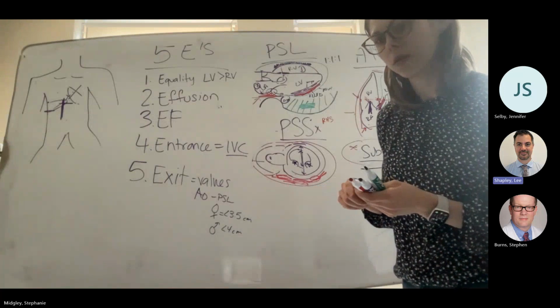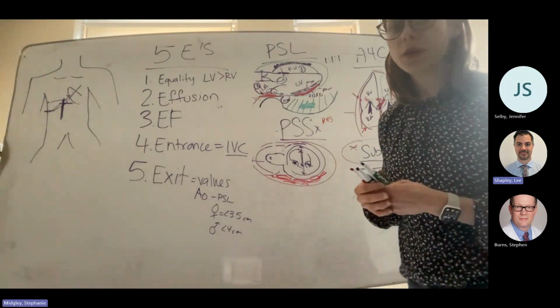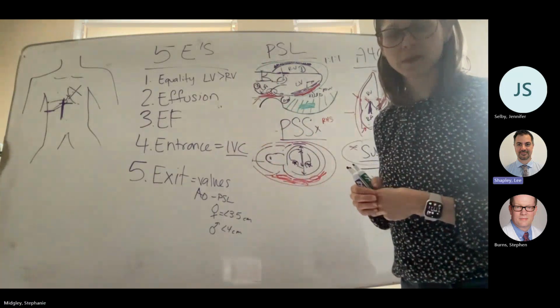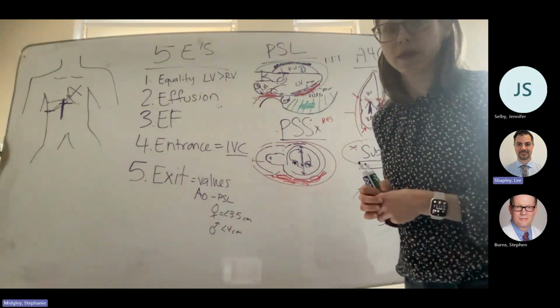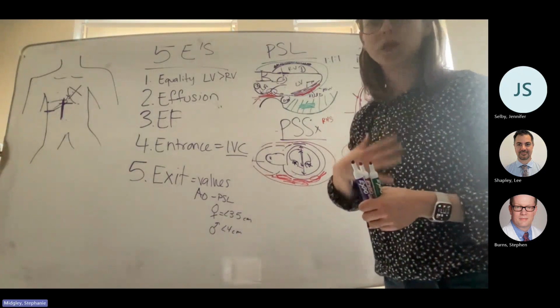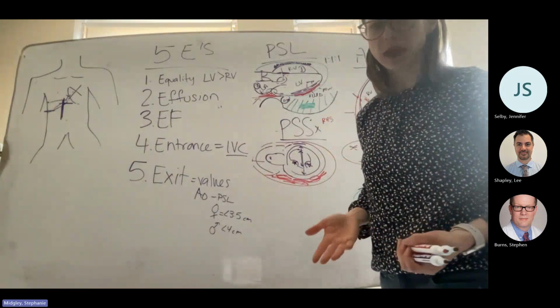I was thinking, what's it going to look like if there's a pneumopericardium? If there's a pneumopericardium, you're not going to see anything. Air will completely obscure anything that you'll see. I had one kid, a little kid, who had a pneumomediastinum. I had no view up here, and I was like, what is going on? Everywhere I tried, I could not see anything. And then I went down and I was able to get a subxiphoid view.